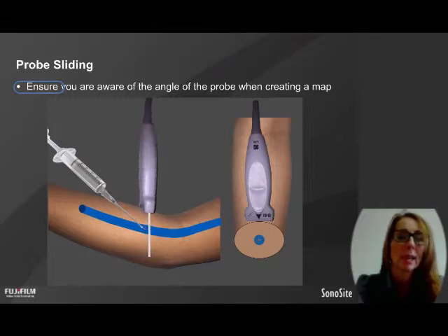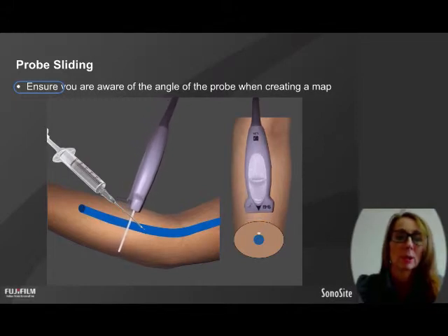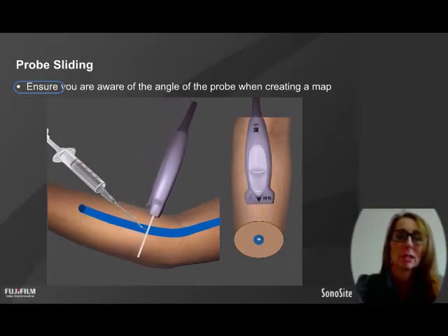So be really aware that you're at 90 degrees to the surface, pointing down at what you want to see, or if you're tilting it, that it's what you've planned to do. Be aware of what your probe's actually getting an image of.